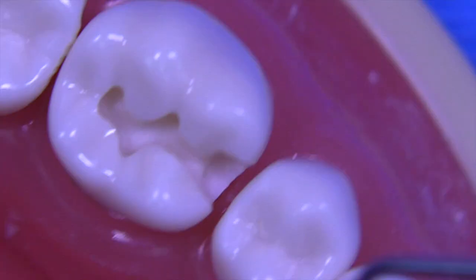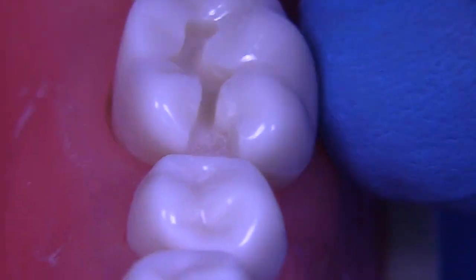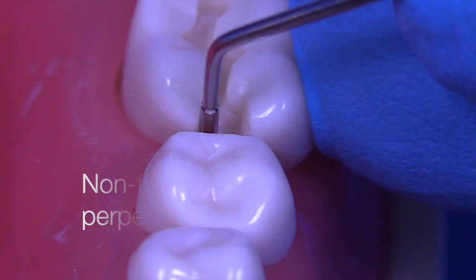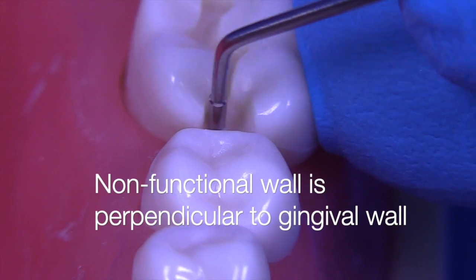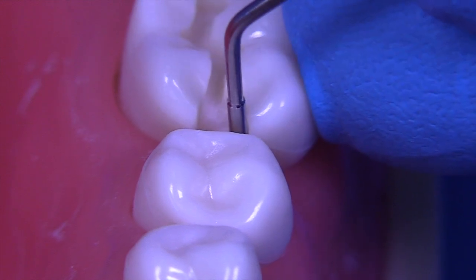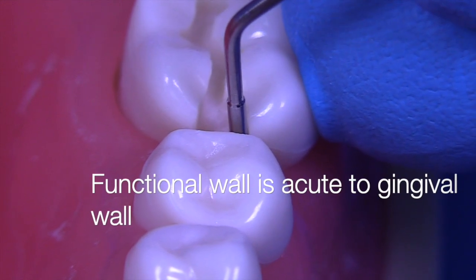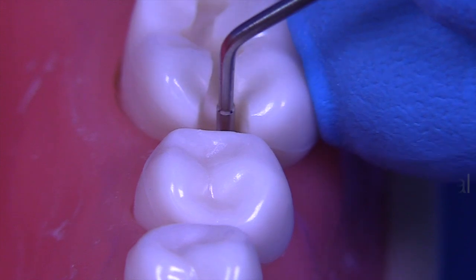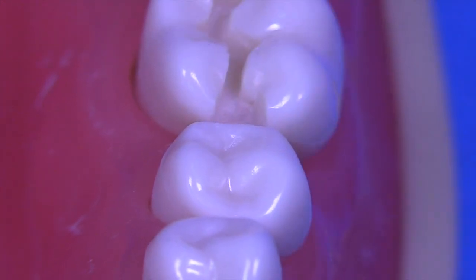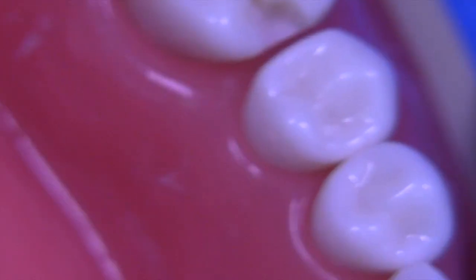Let's take a look at the convergence of the box. We want to make sure that the non-functional wall of the proximal is straight up and down and perpendicular, or orthogonal, to the gingival, and the facial wall should be converging slightly towards the lingual with respect to the gingival. So I think you did a pretty good job with that particular situation.